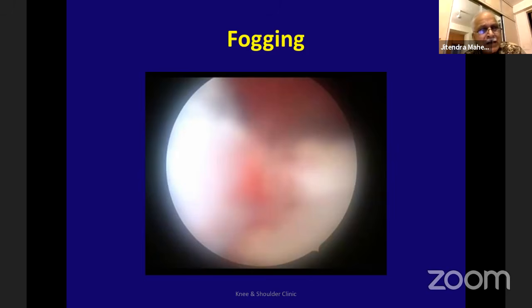As I discussed in the last presentation, from the medial meniscus and medial condyle of the femur, you follow the notch. As you come to the middle part of the notch, you'll have some confusion because of the ligamentum mucosum. You move over it and come to the lateral side.